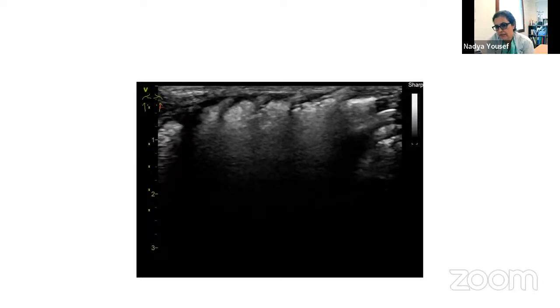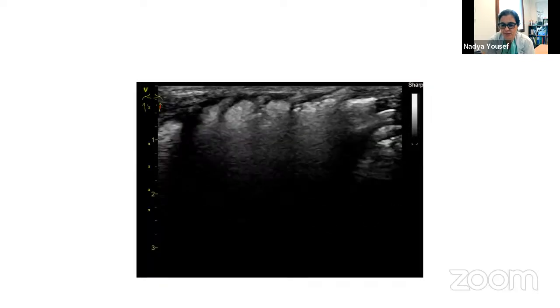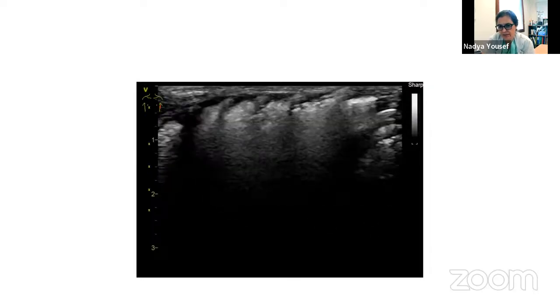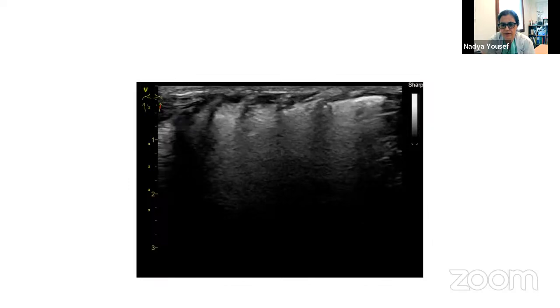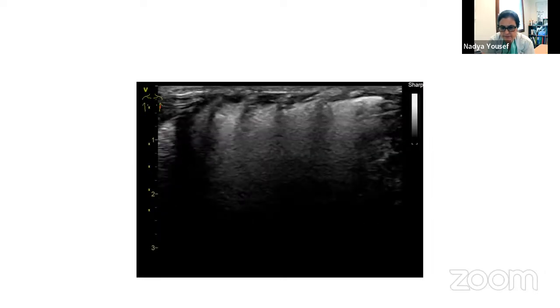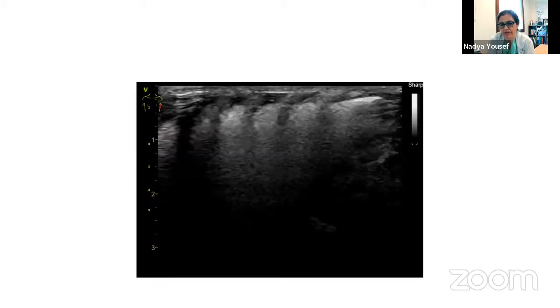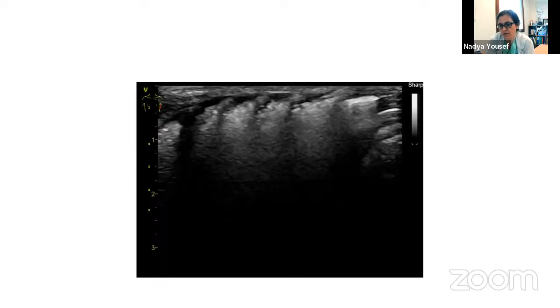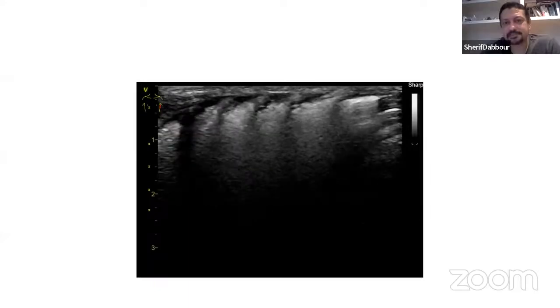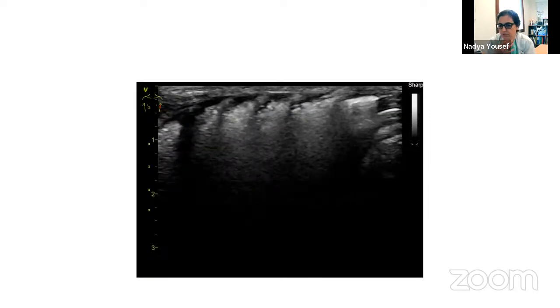Well, he's 10 days old, so without making a diagnosis on RDS or not, I totally agree with you the way you've reported. It's really clear and it sums up perfectly what we're seeing. However, what we can say is that it is a non-aerated lung in an infant who has had RDS and is probably progressing to BPD or not. But in any case, it's a severe interstitial syndrome. Yeah. And then we can call it RDS, post-RDS, beginning progression towards BPD, whatever you want to call it.